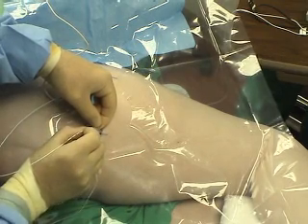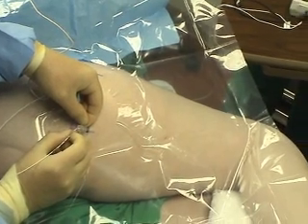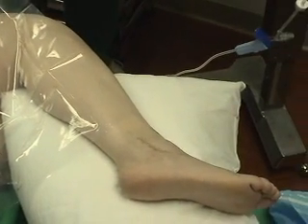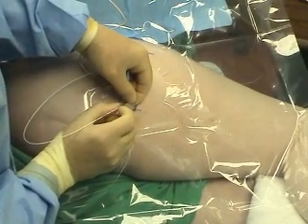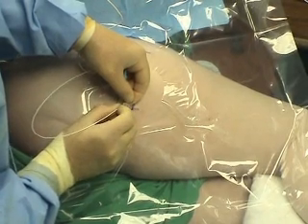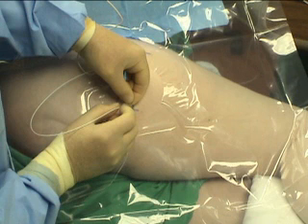This part of the catheter is placed in the palm of the left hand. The catheter tip is then placed into the shaft of the needle, and the muscle twitches should remain brisk and unchanged. Note that the broad black mark on the catheter indicates that the catheter tip is situated at the tip of the needle, but it is not yet protruding from the needle tip. The needle should never be manipulated if this complete broad black mark is not visible.